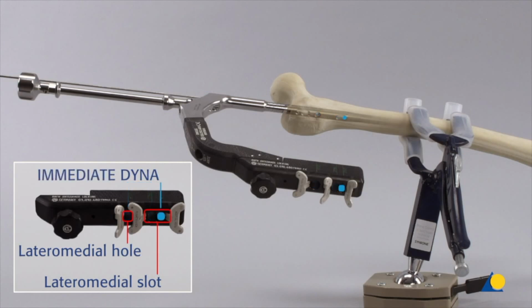For immediate dynamization, one proximal locking screw is inserted through the distal hole in the aiming arm. For later controlled dynamization, insert both proximal locking screws. When dynamization is desired, the most proximal locking screw is removed. This presentation demonstrates dynamic standard locking.